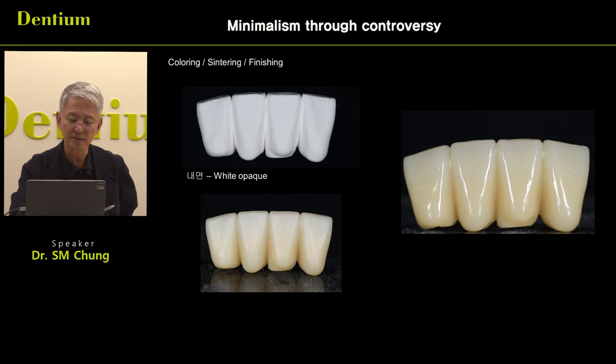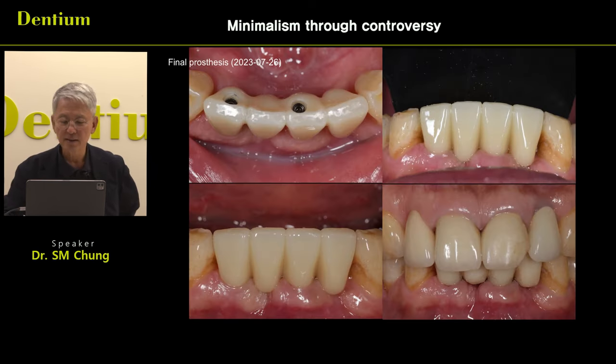After final millings and the sintering and the glazing, pressed into the mouth, a little bit whiter because the neighboring tooth has some plaques, and a little bit darker. But the patient wanted it to be a little bit whiter, so we have applied these final processes.